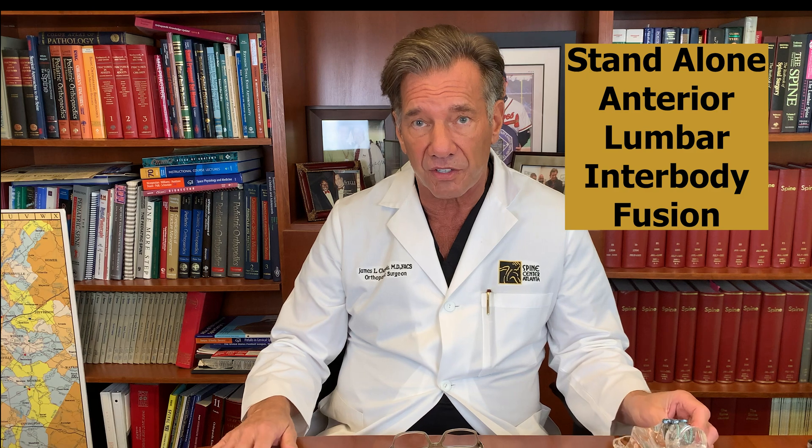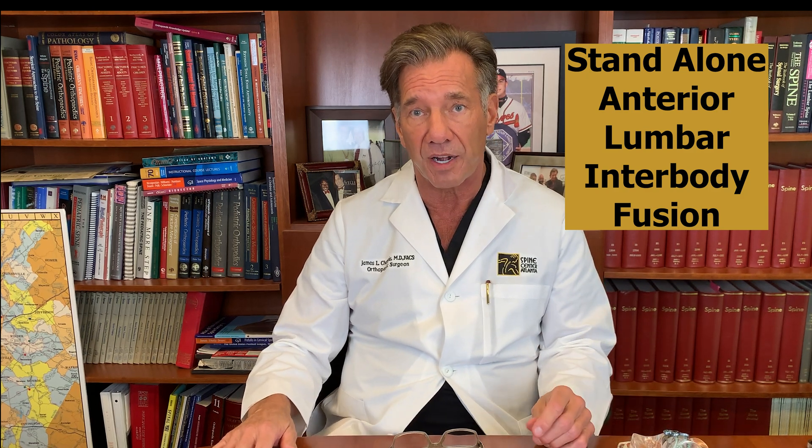With the microscope, we remove the disc that's herniated and any spurs that are pushing on the spinal cord, and then we put an interbody fusion device. There are a number of these on the market. The one we like to use is shown here — it's called Infix. We put bone graft and Infuse BMP in the cage, and then we put a plate and screws over that. That's called a standalone anterior lumbar interbody fusion.